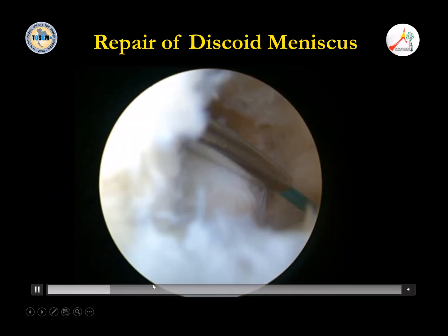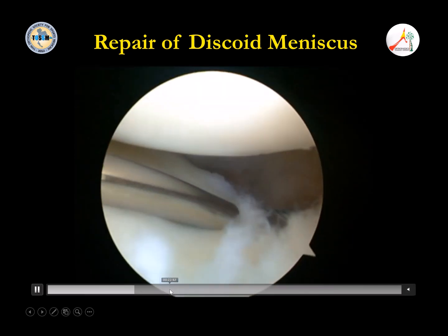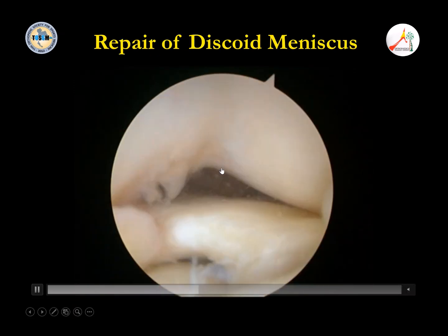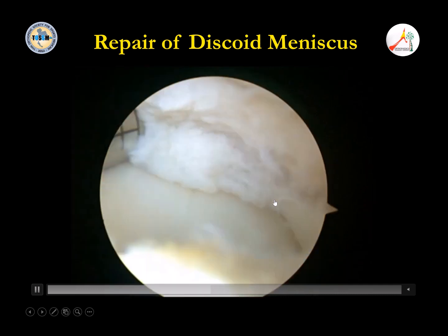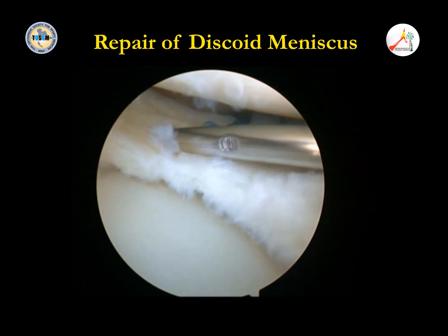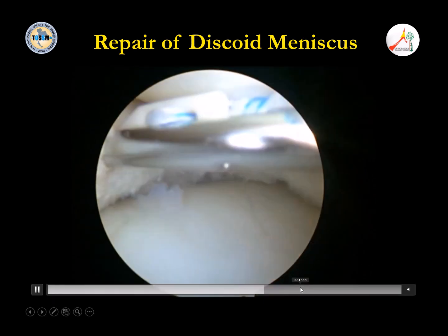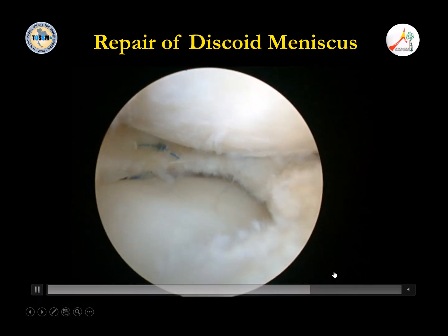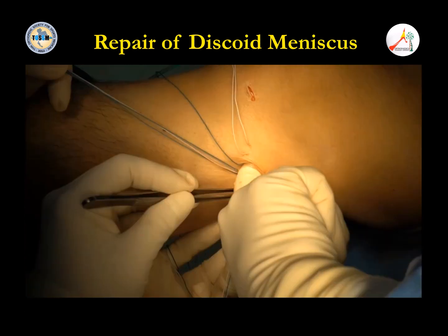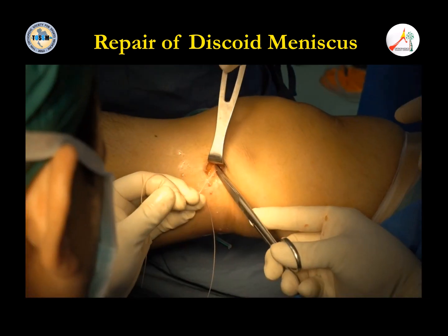First we do the reduction using inside out to the capsule, like that. So many inside out sutures, and then we trim the bucket handle, shave the tissues, and then you repair in the same technique. Finally, you get the nice meniscus back again, and then we make a small incision and tie the suture on the capsule.